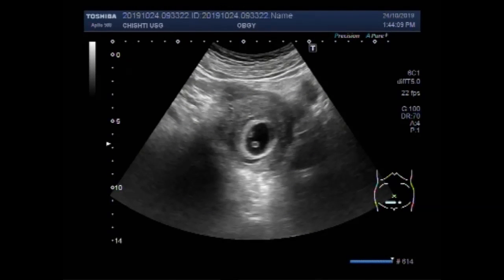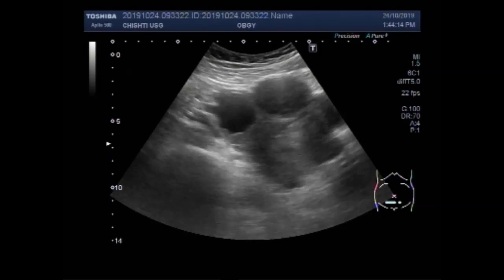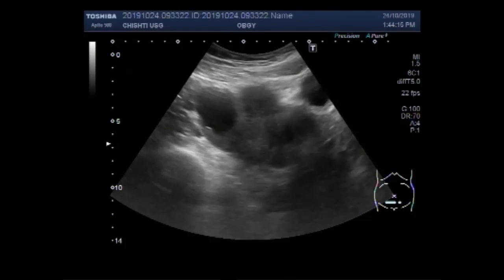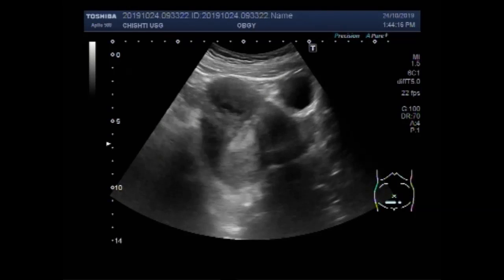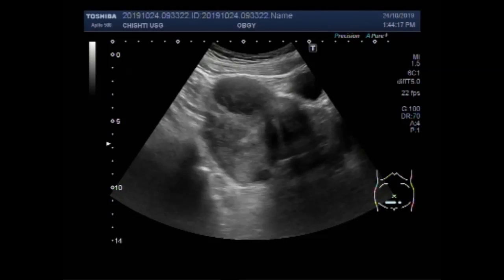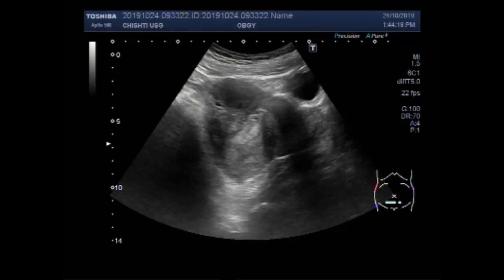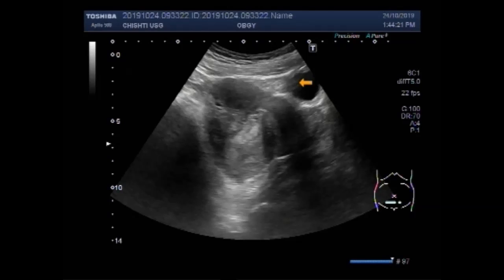Dear viewers, I hope you are all fine. This ultrasound video shows an early pregnancy with a uterine mass and an ovarian cyst.